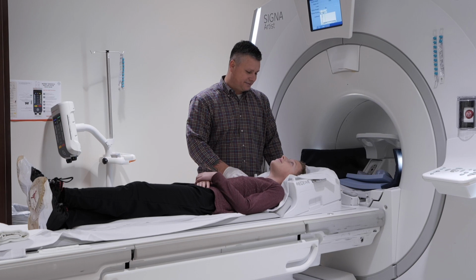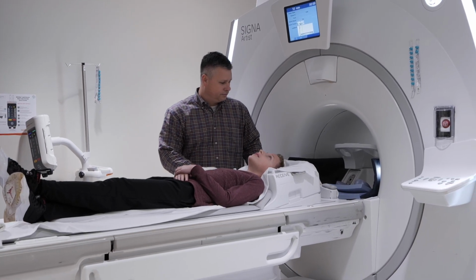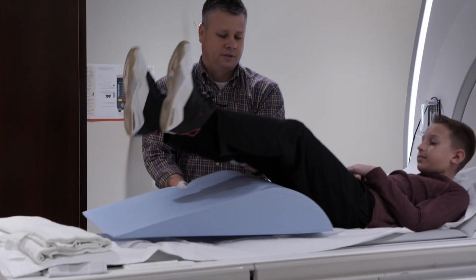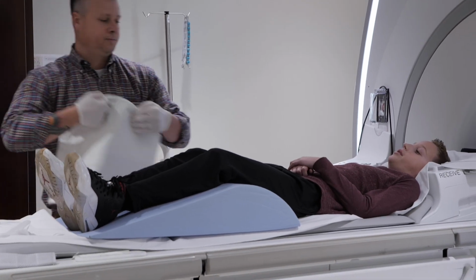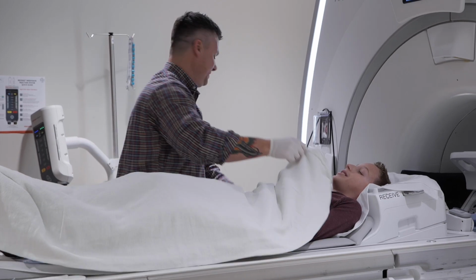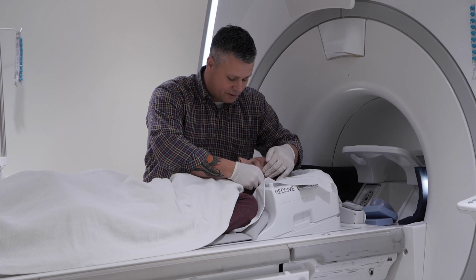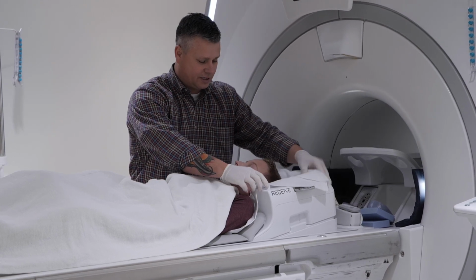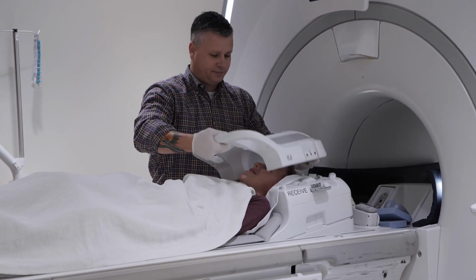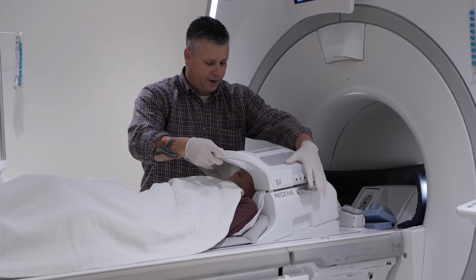When you walk into the MRI room, you will notice the MRI machine looks like a big metal donut. The MRI team member will help you onto the MRI table that looks like a small narrow bed. Your team will put a foam block under your knees and give you a blanket to help you feel more comfortable. They will also give you a pair of earplugs because the machine can get loud. If you are getting pictures of your head or brain, the team will place something that looks like a helmet over your head and give you some padding.